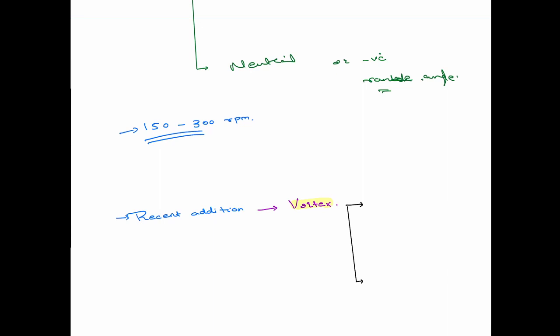What they have done is, there is no radial land cross section, and there is M-wire technology, and that's why they come under the later generations. I said thermally treated, fourth generation, isn't it? So it's M-wire technology, Vortex. So Vortex is a modification of profile system.